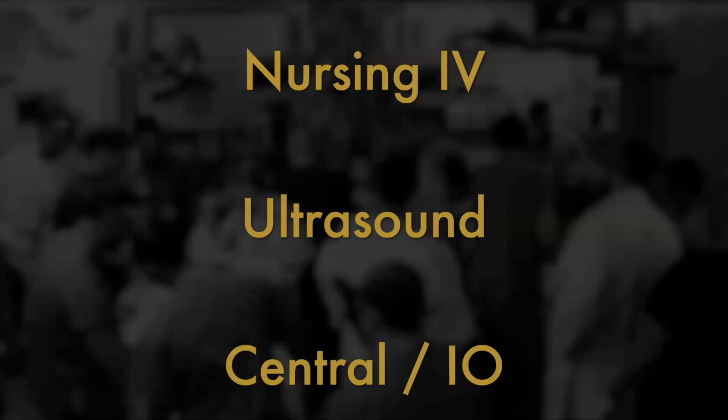First, we rely really heavily on our nurses to get an IV. And then if that doesn't happen, usually someone's yelling, all right, let's go get the ultrasound, and we fish around there. And then when that fails, I feel like a lot of us are pretty quick to say, all right, this is an indication for central access, or let's just put an IO in and start infusing through there. And that's all well and good, but I want to refine this a little bit more. Maybe we can work together to get a couple extra pieces into this algorithm.